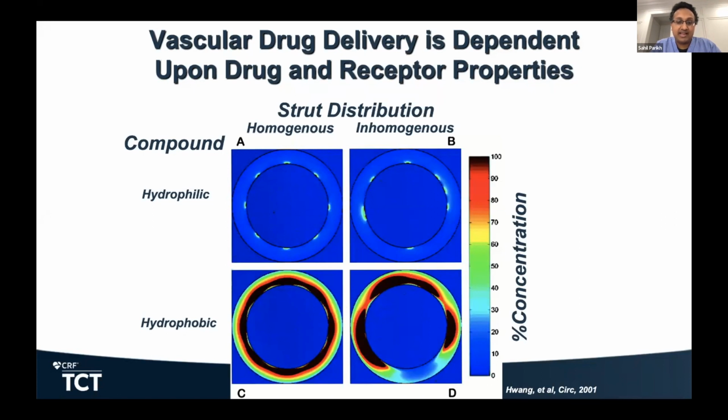So that's one. The second thing is, does the polymer affect the drug? And the answer is no, unless it does not adequately deliver the drug for long enough. Polymers are very, very easily and carefully tuned to provide drug concentrations that are quite steady. You can pretty much set a step function of drug concentration if you know how to tune your polymer. And so if it's done right, the polymer makes it a lot easier.